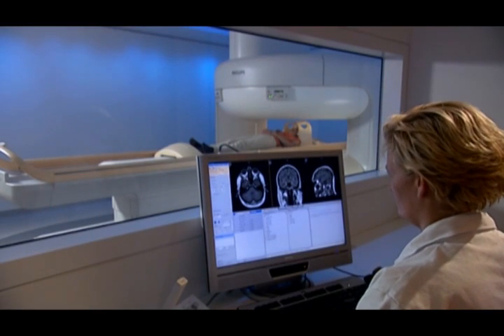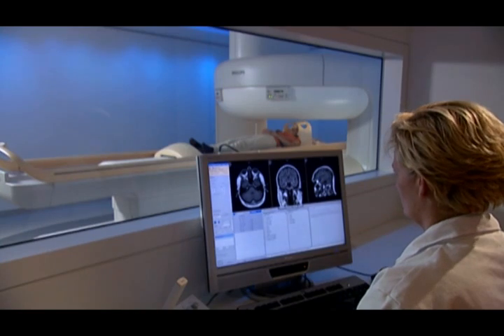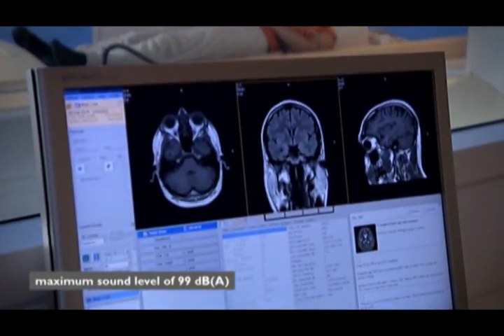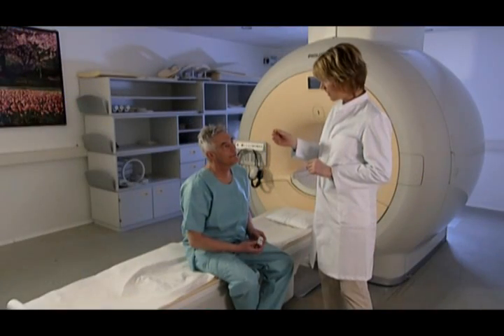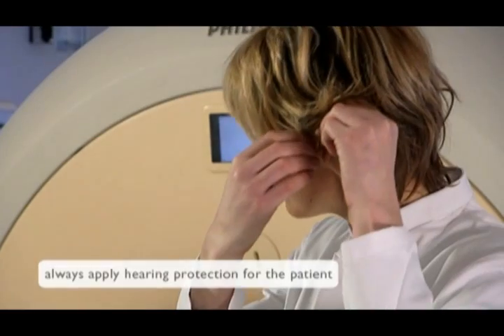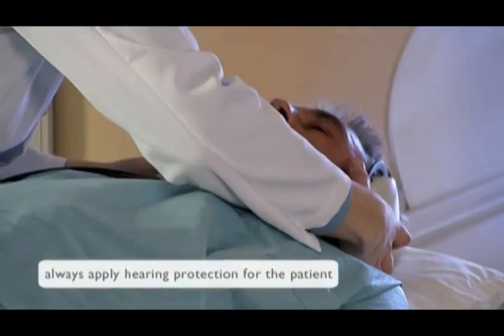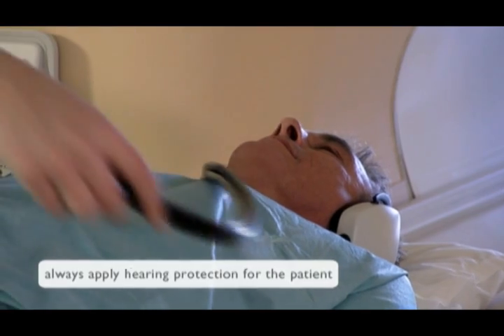International MR safety standards for patients allow a maximum sound level of 99 dB/A for up to 1 hour. To keep the exposure below this level, some hearing protection in the form of earplugs or a headset is necessary and obligatory for almost all MR systems.